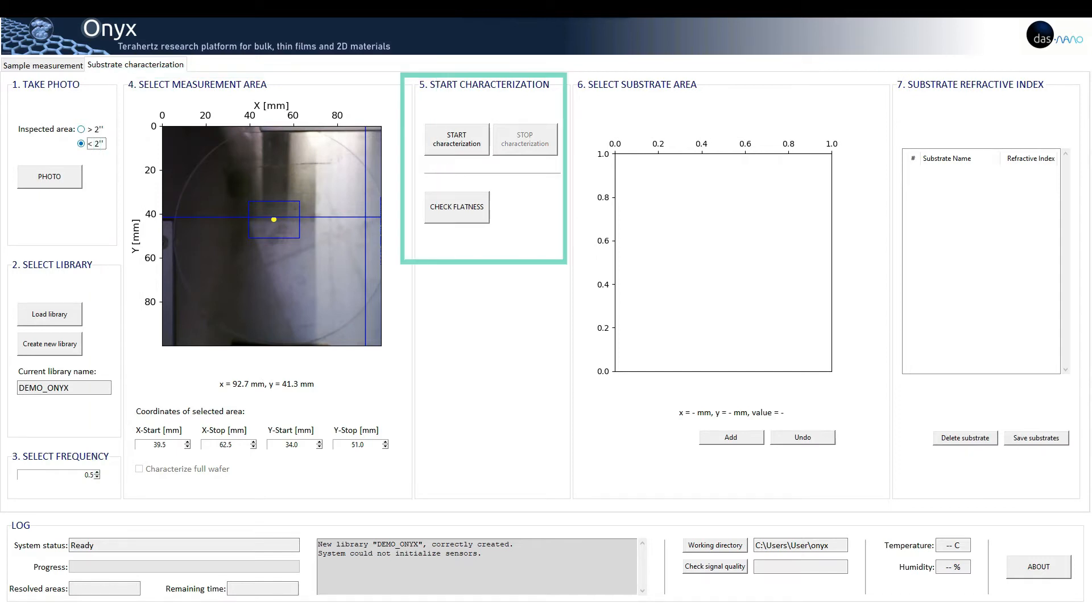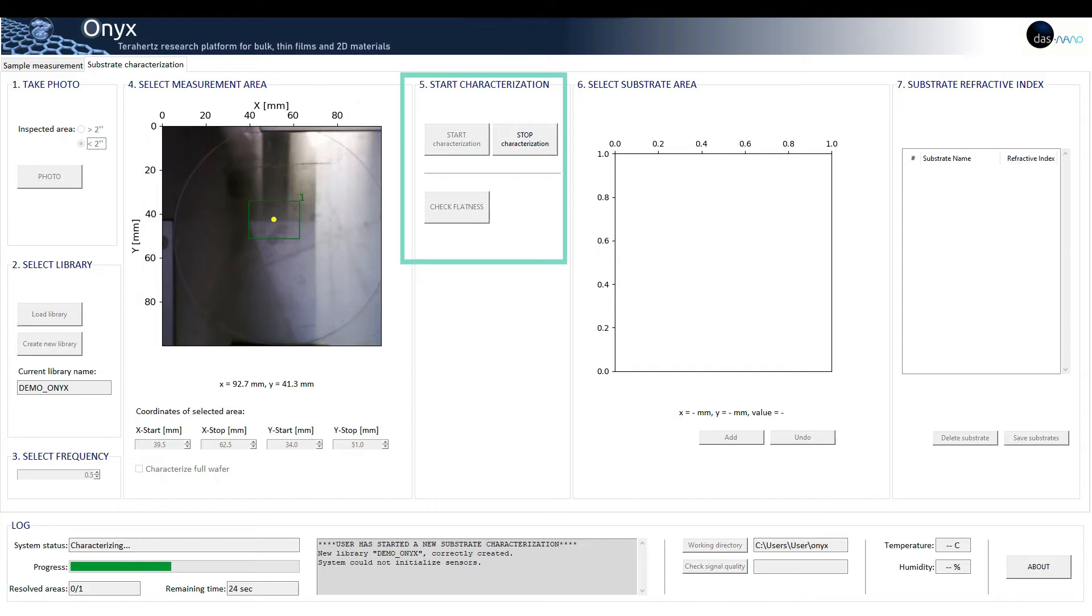Five: start characterization. Just click on start characterization and ONIX will start the measurement.